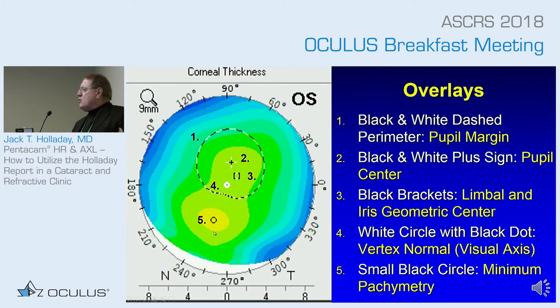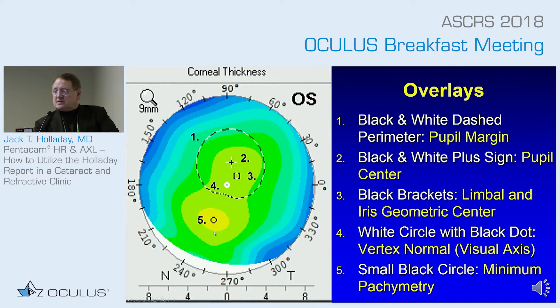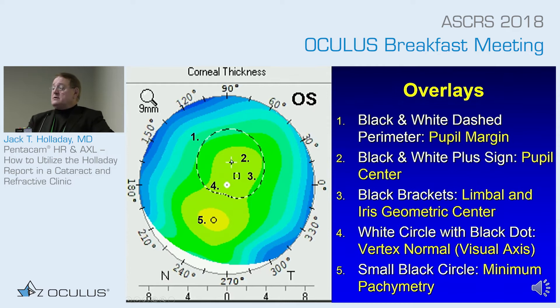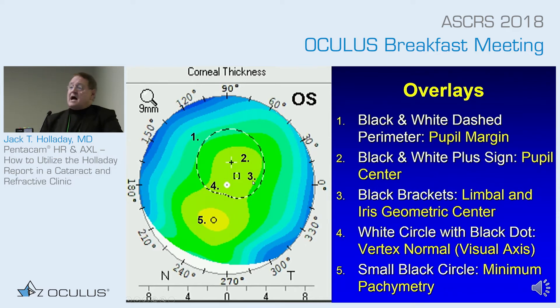There are five overlays you need to know — things that appear on top of the map. The first is the dashed line: the pupil margin, which follows the contour of the pupil perimeter. The pupils are usually miotic because the bright lights are on. The second is a little crosshair — that's the pupil center, the centroid of that perimeter. The third is the center of the iris or limbus area.